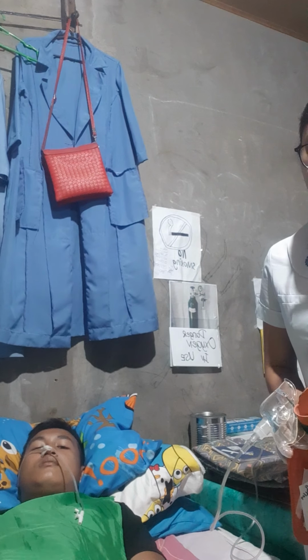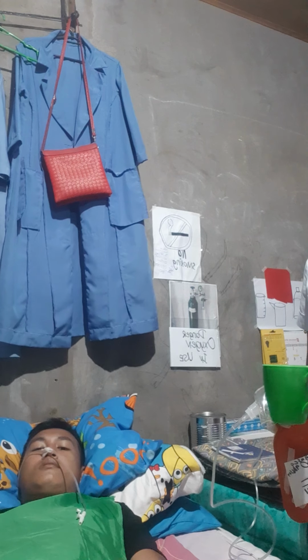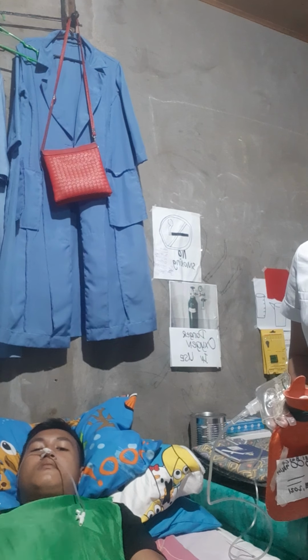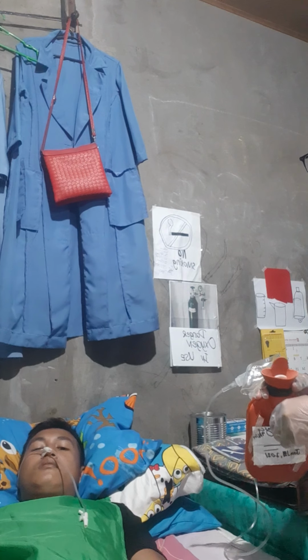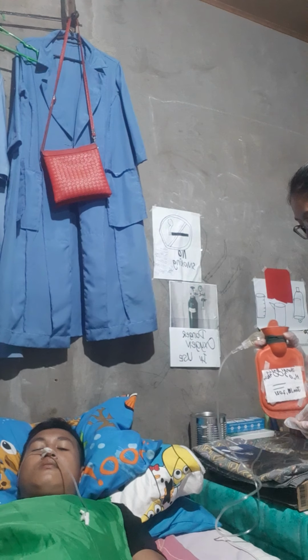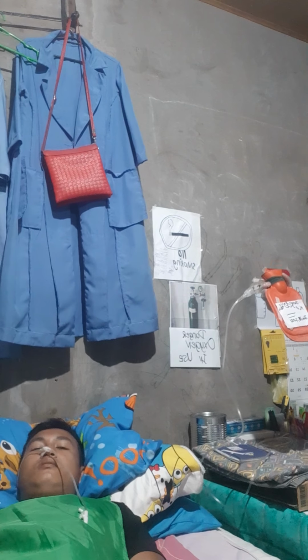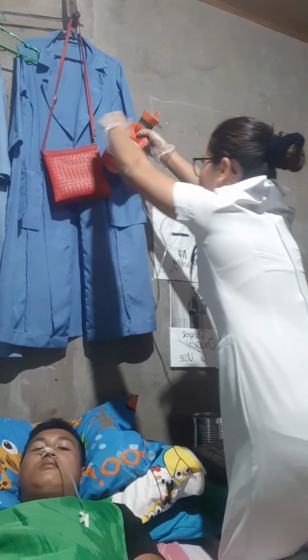Then we need to open the clamp, run the formula through the tubing, and reclamp the tube. Then we are going to attach the bag to the tube after hanging it.